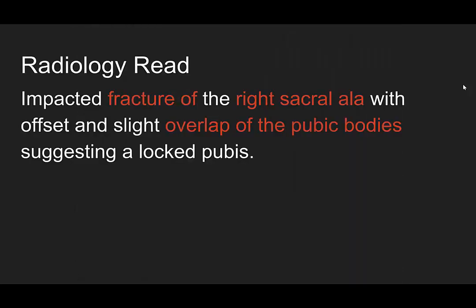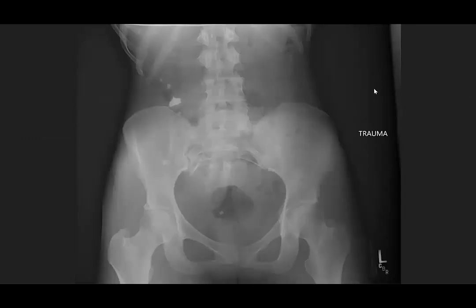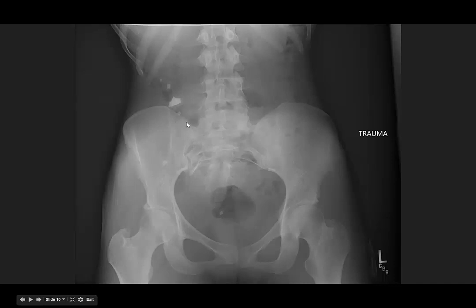Let's take a look at the read. There's an impacted fracture of the right sacral ala, with offset and slight overlap of the pubic bodies, suggesting a possible locked pubis. Let's go by our system. Take our iliac wings out here — you can see maybe there's some irregularity as it lines up with the sacrum. The beauty of the pelvis: if you see irregularity on one side of a ring, you should probably look to the other. Right here, we have a break in that line — a cortical irregularity between your sacrum and your ilium. That's that offset right ala they're talking about.